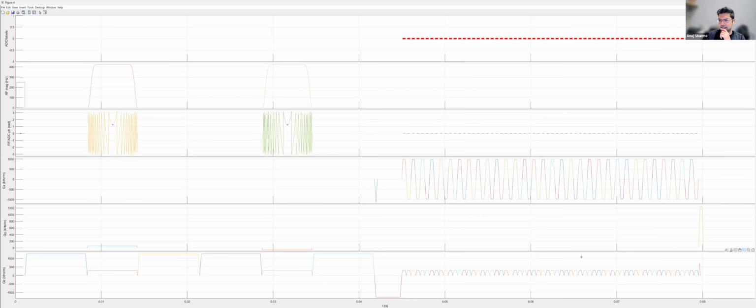Now, this is where I think the constraint comes in. So right now, the GZ is blipped, which is a bypass for me. So ideally, I would want to play a flat GZ because physically they have the same effect, but blipping it up and down is just inefficient. So I would like to play a flat GZ simultaneously with this bipolar. So now I think I can do this in IDEA, because in IDEA, when we add an event, we specify the time at which that event should be played. So I can tell it wherever to play in the block.